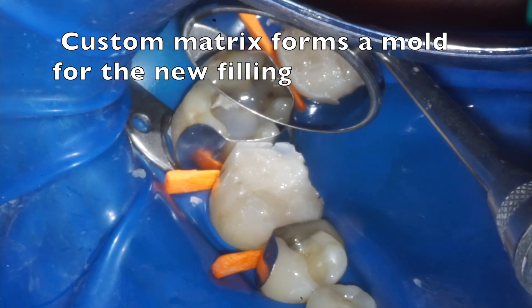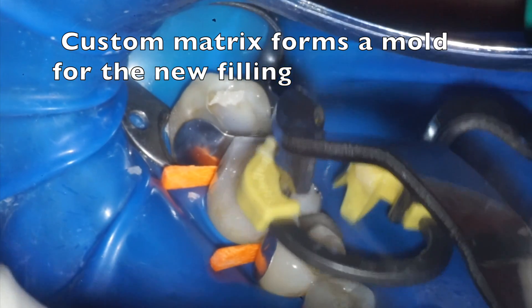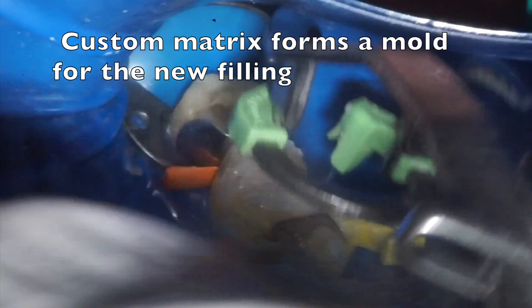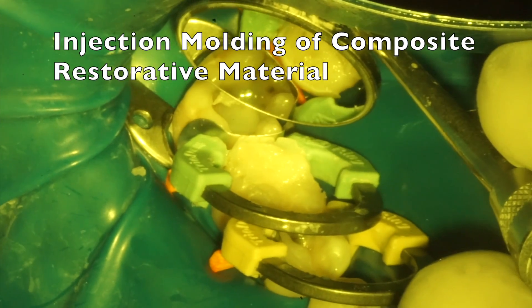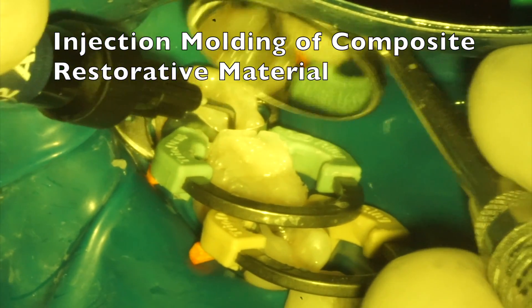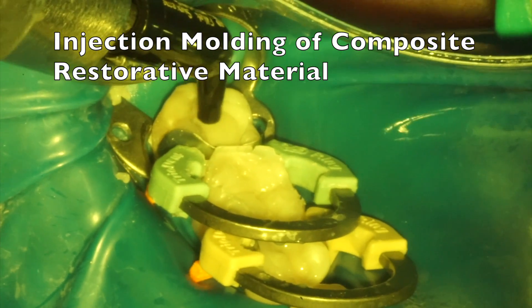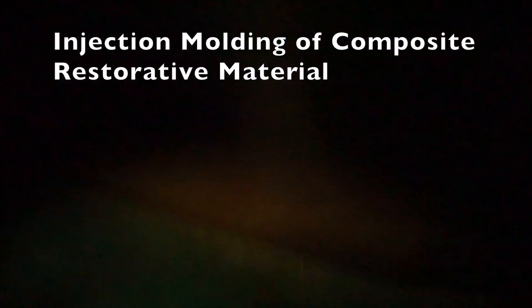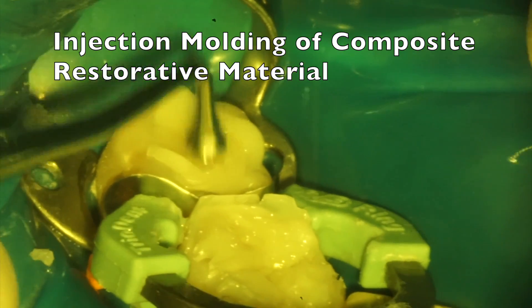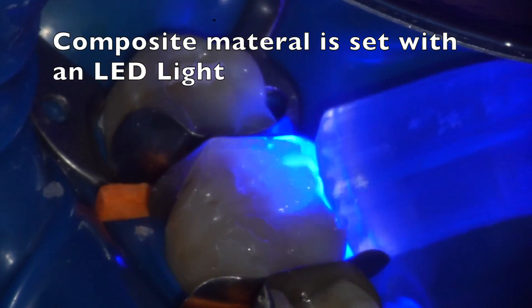Now the teeth are being bonded and filled. We create a custom matrix that will give the tooth a natural shape. This custom formed matrix is injection molded with composite material. After the injection molding is completed, the filling material is shaped and then set with a special LED light that hardens it instantly.